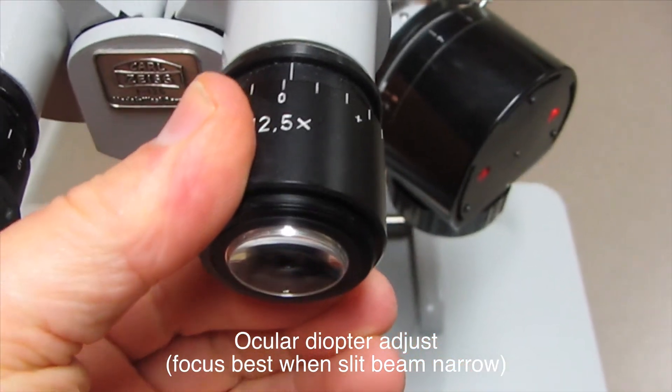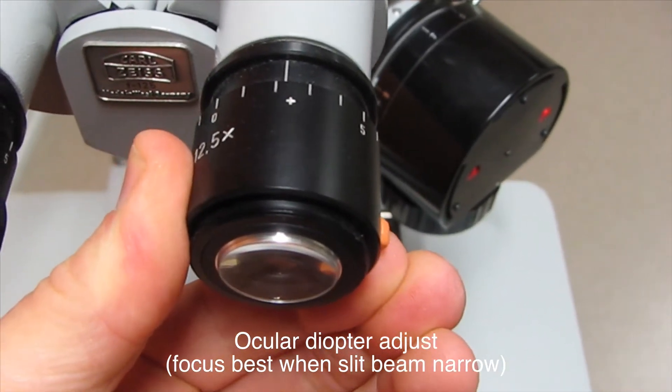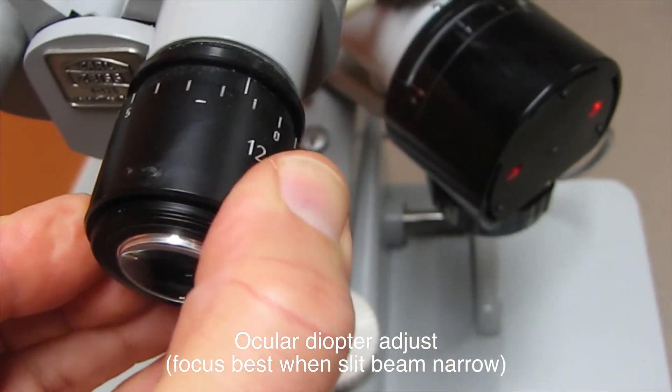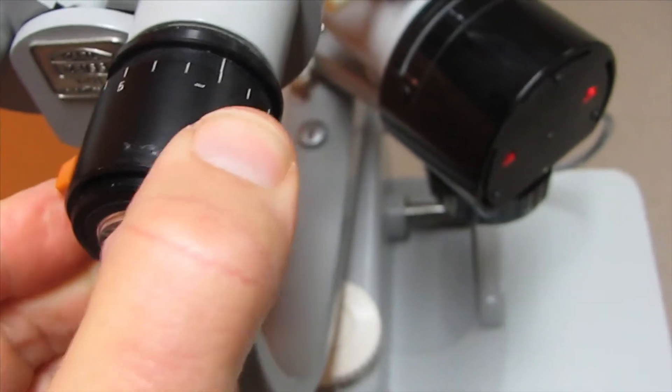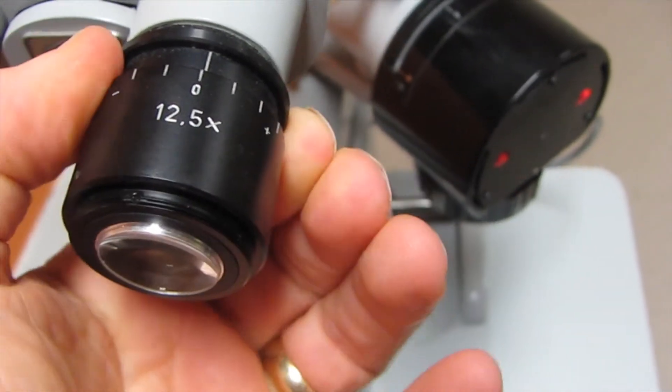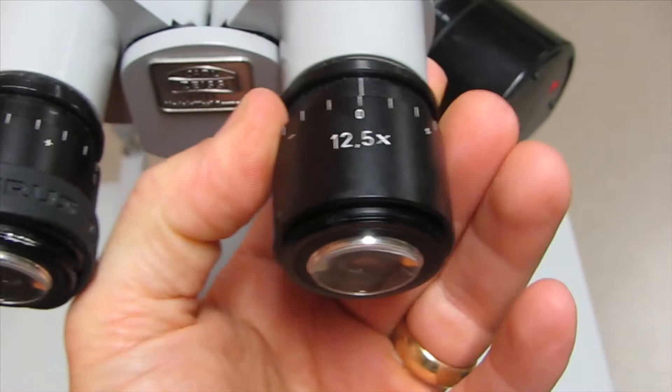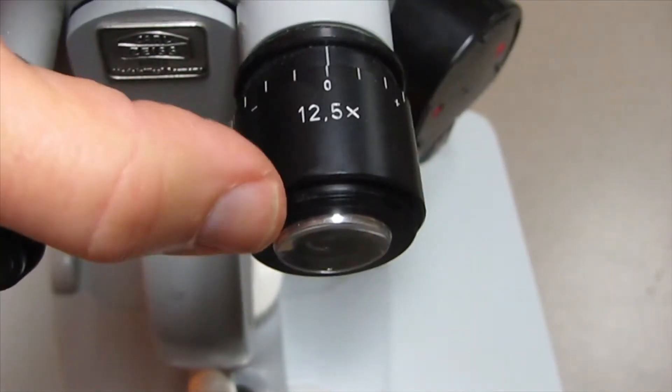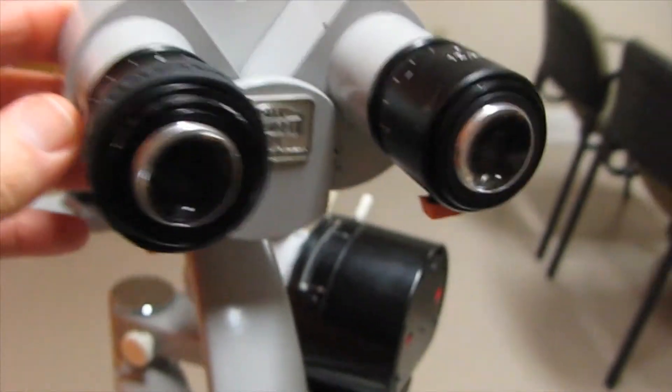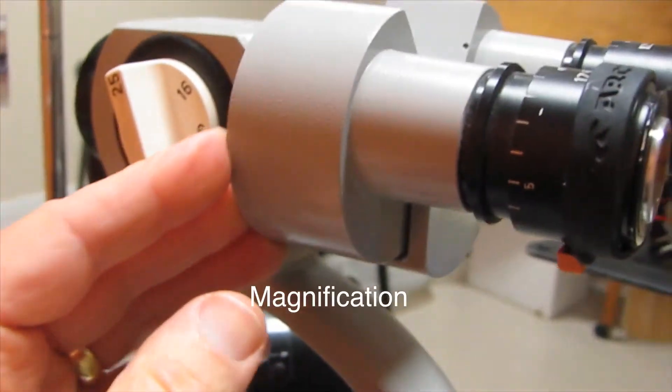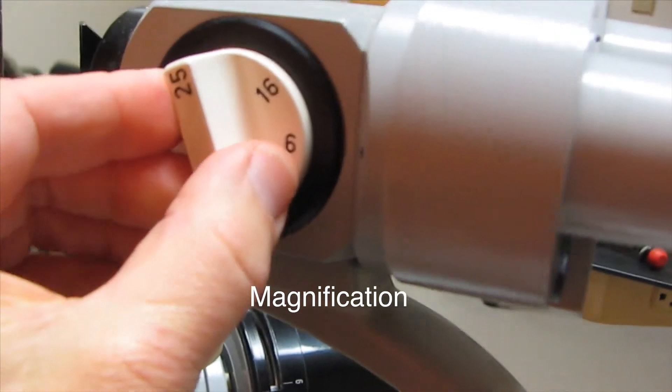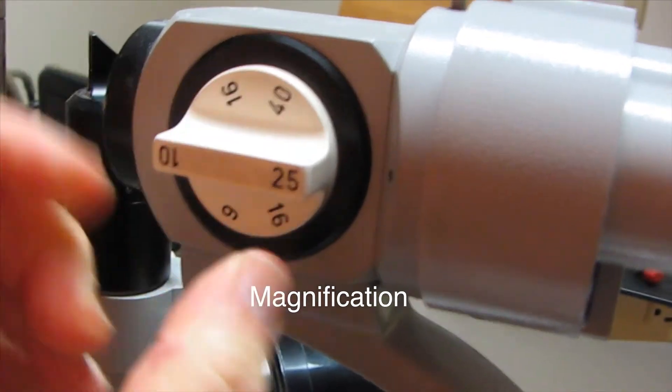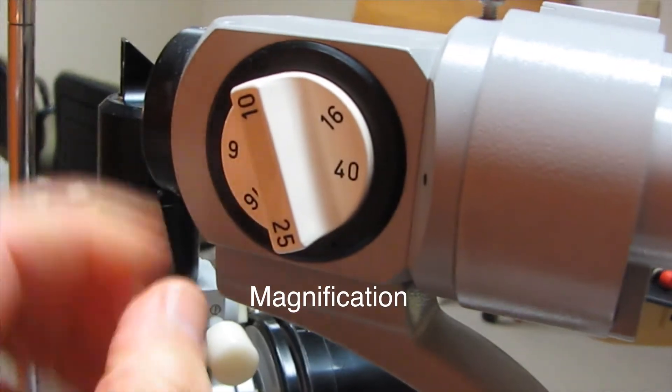You can add plus or minus if you're near-sighted or far-sighted, but most likely you'll want to keep the microscope at zero on both sides and keep it slid in well. The oculars have this focus on a Zeiss slit lamp up to 40x.